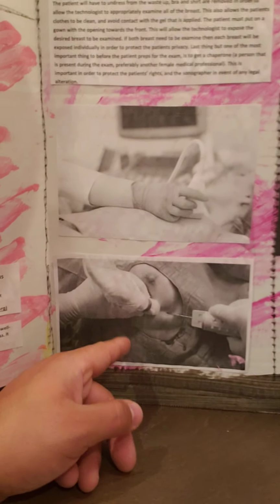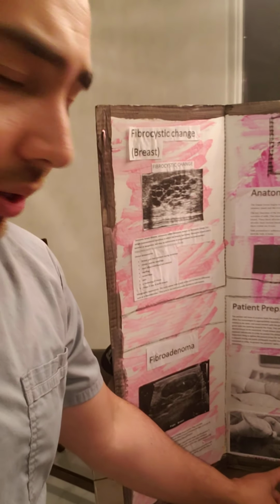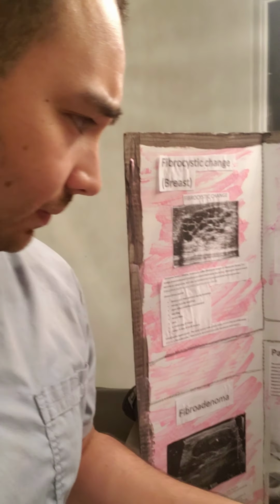And then I put here, as far as biopsy, basically the patient ungowns as well. Biopsy means when they're going to take a sample of tissue away from the breast to test if it has any cancer or anything abnormal in it. Ultrasound is used for guidance in biopsies. Basically, the doctor grabs a probe or the biopsy gun, which is inserted into the tissue, and it's the one that takes the sample out. And ultrasound guides the needle to where the tissue of interest is located.